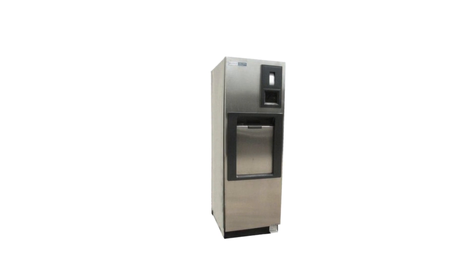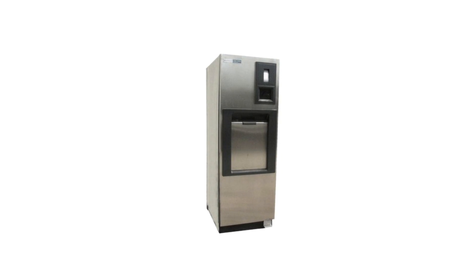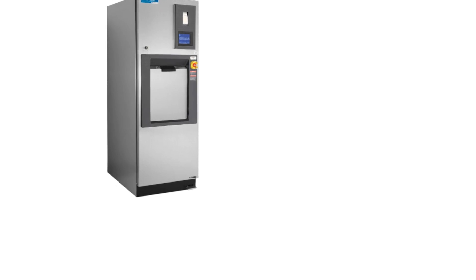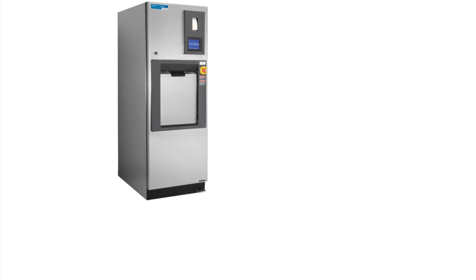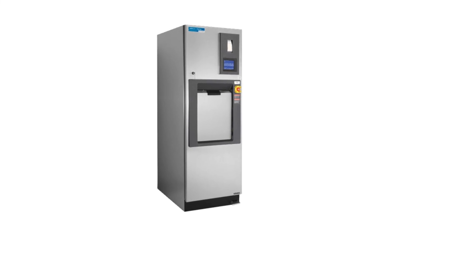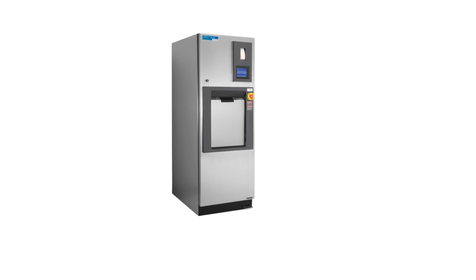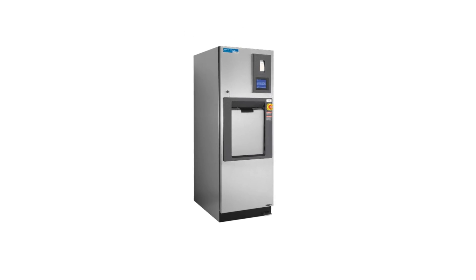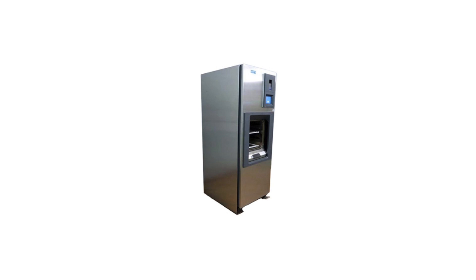The Sentry V116 has a chamber size of 16x16x26 inches. The Steris AMSCO V116 has an overall height of 74.5 inches and an overall width of 30 inches. Its operating temperature ranges from 250 to 270 degrees Fahrenheit.